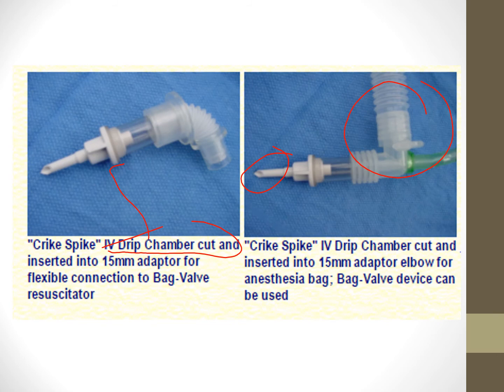So you can bag, you can ventilate, oxygenate. Just understand it's going to still be difficult. All right, it's not going to be perfect, smooth sailing once this is in. You still have a difficult road to ventilate and oxygenate a patient with such a small airway, and hopefully that stabilizes them enough to where you could put in a tracheostomy, a perc trach or an open trach, but perc trachs are done faster usually.